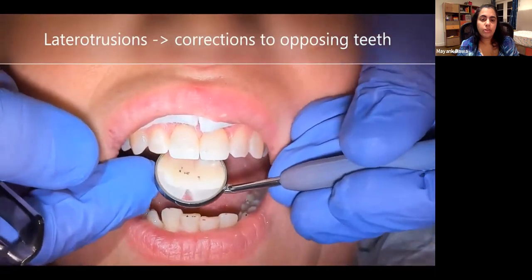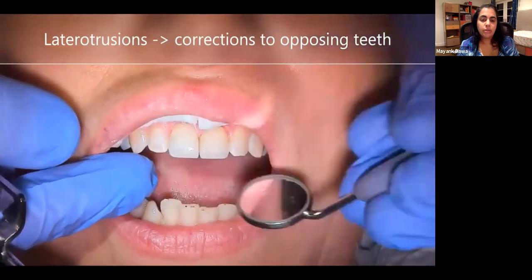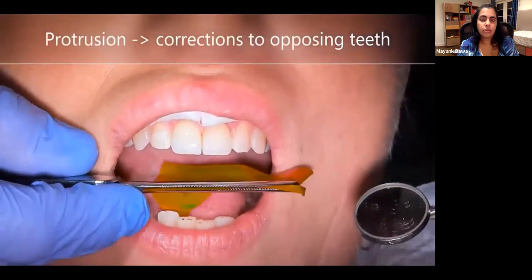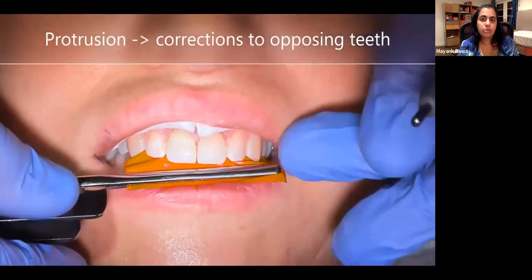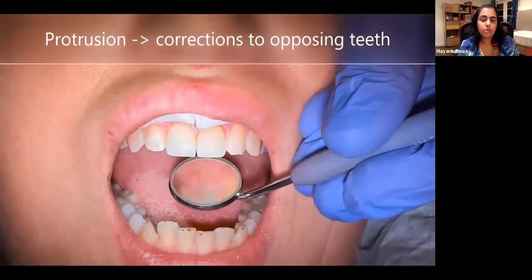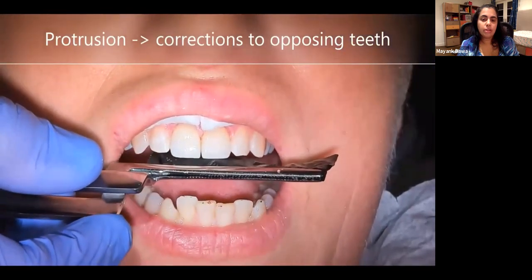When the blue one is being used, the patient is biting up and down. Now protrusion. So all the excursive movements are with a different color articulating paper.